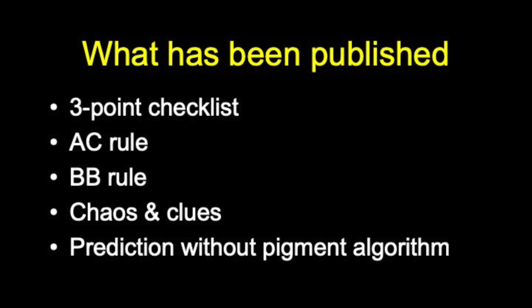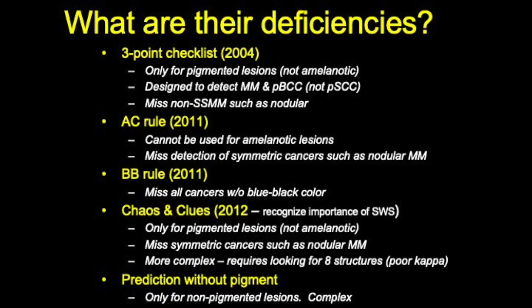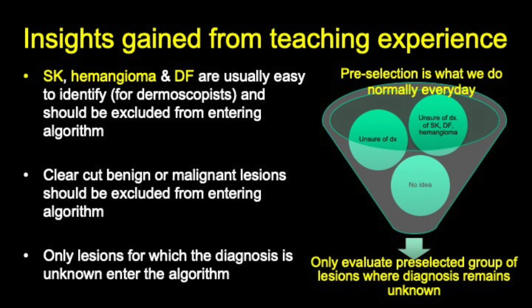So they don't encompass everything, okay? So the question was, can you actually take all of these and amalgamate them into one that encompasses everything but is easy to use? Now, together with that, there's a couple of new pieces of information that these previous algorithms weren't privy to, and they were not included.